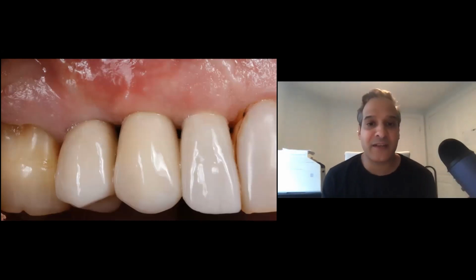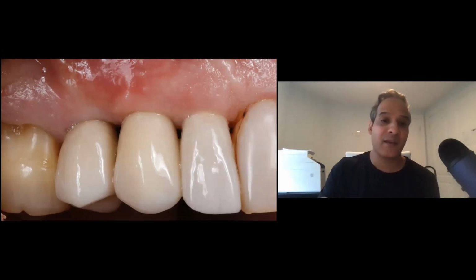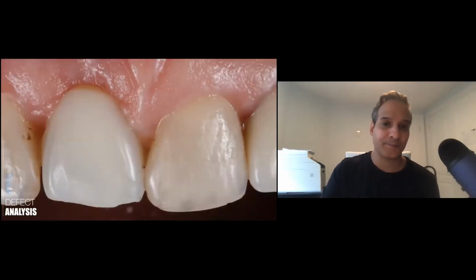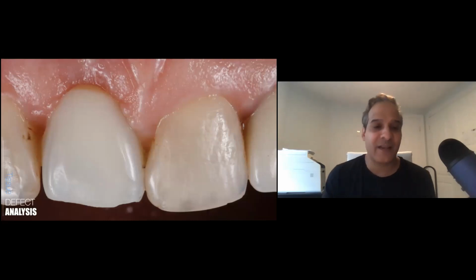Okay, so you can see now they actually did some crown work on the lateral as well. The canine itself is an implant, and now the premolar, the 1-4, there's an implant. But you can see now the healthy, thick tissue profile. And from an aesthetic point, it just looks much nicer. Now here's another case. Again, for guys, the key to doing aesthetic implant restorations is not bone, it's soft tissue.